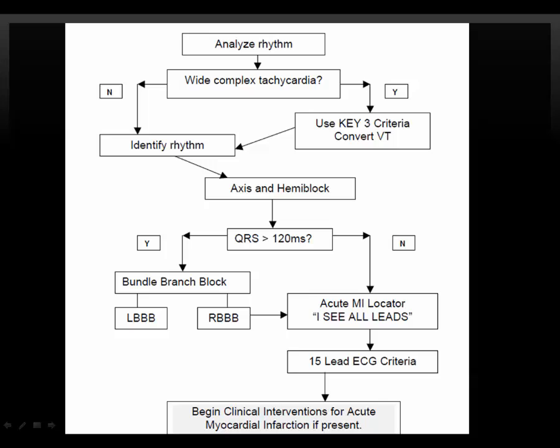Here's an algorithm to use to help you through the steps shown in this presentation today. At first, doing multi-leads may seem a bit awkward. There may also be those who have never heard of it, or others who give you a hard time about multi-lead things such as lead placement and running extra leads. Remember, however, that is your patient. You always want what's best for your patient.